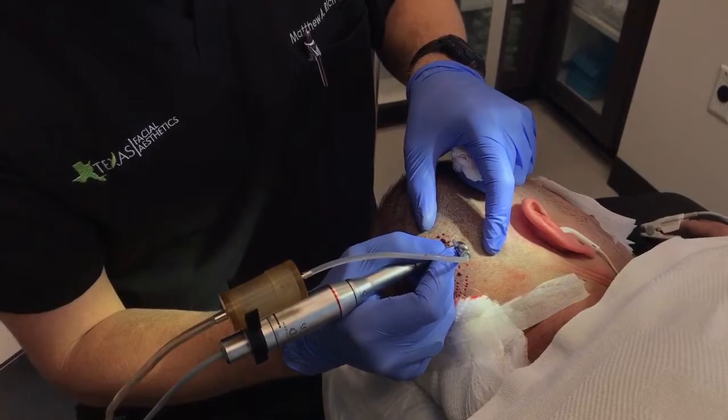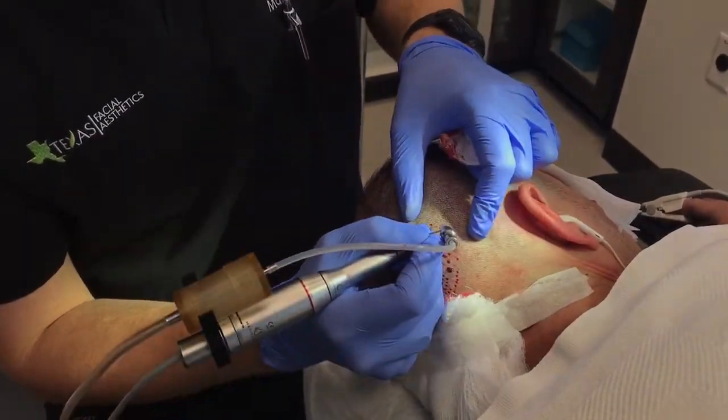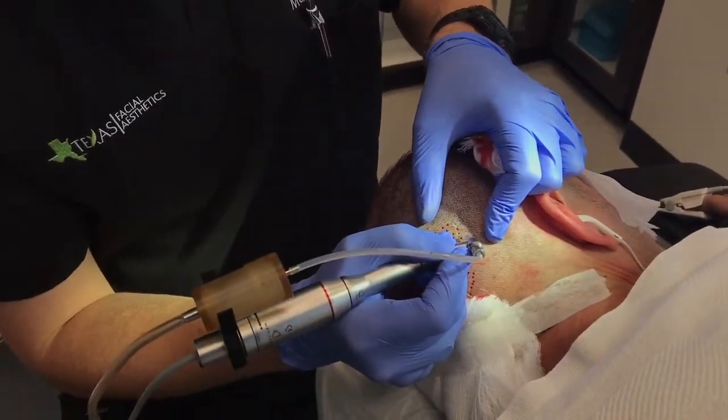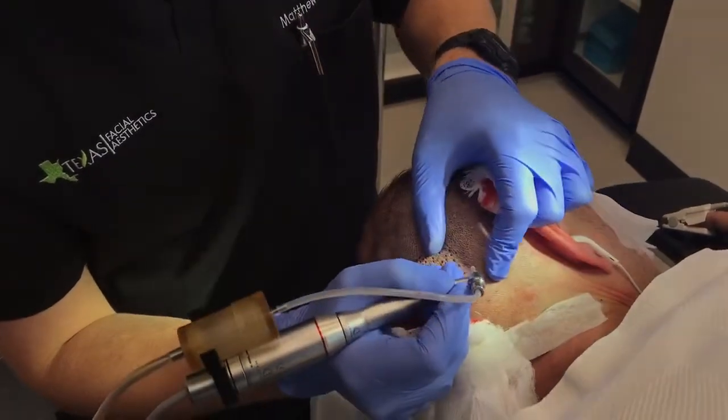We're taking them one at a time from these little holes, and then we're going to move them to a different area in the scalp. These follicles that we move will then grow.